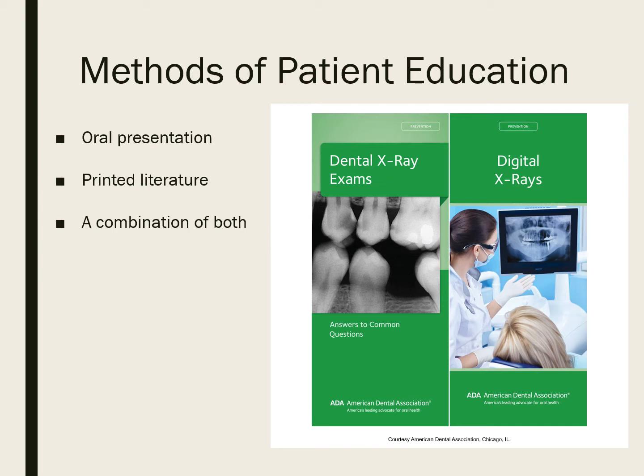Most patients will appreciate the dental radiographer just for taking the time to discuss dental images with them. I can't tell you how many times I've explained which X-rays I'm taking and what those X-rays are looking at with my patients, and it helps them to agree to the treatment. Patients are a lot more likely to trust you, and explaining it to your patients shows that you're confident in the need to take these X-rays as well.